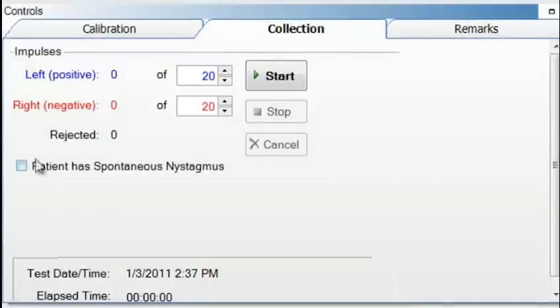For patients with spontaneous nystagmus, select the checkbox patient has spontaneous nystagmus. This prevents good impulses from being rejected inappropriately.